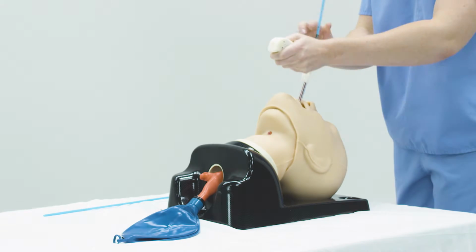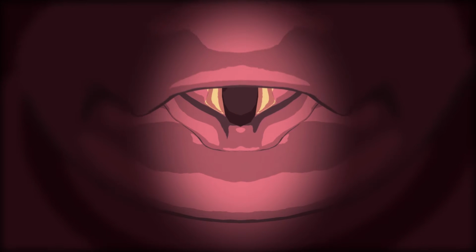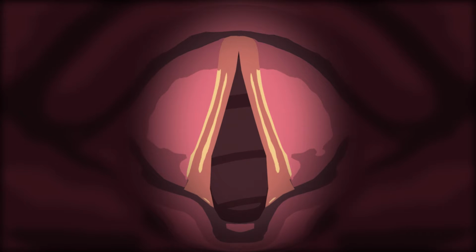Another significant advantage this device has over other intubating laryngoscopes is due to the scope having a circular transparent tube with excellent illumination, which can be used to identify key laryngeal structures to give the user an idea where the vocal cords may be located. As a rigid, enclosed tube, tissue can be displaced by the tube to still give the user a straight line of sight view of the vocal cords. So if the epiglottis is seen, the user passes the scope beneath it, or if the arytenoid cartilage is seen, then the user passes the scope towards the midline, for example.